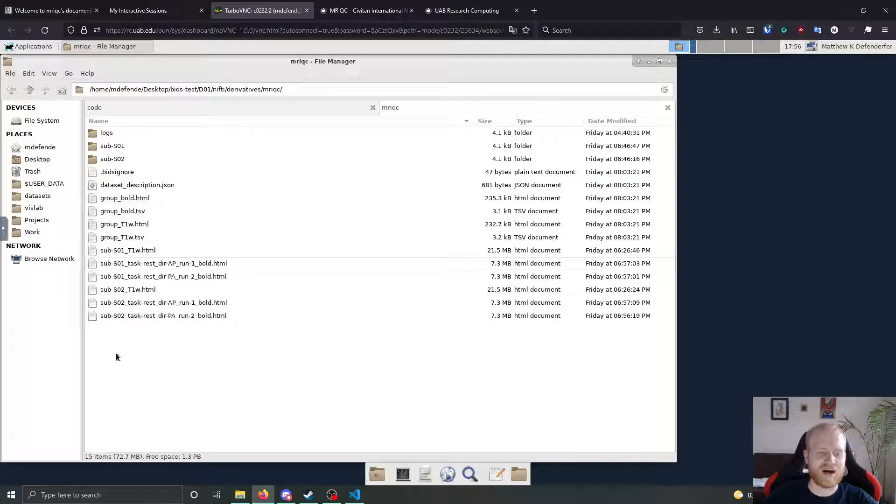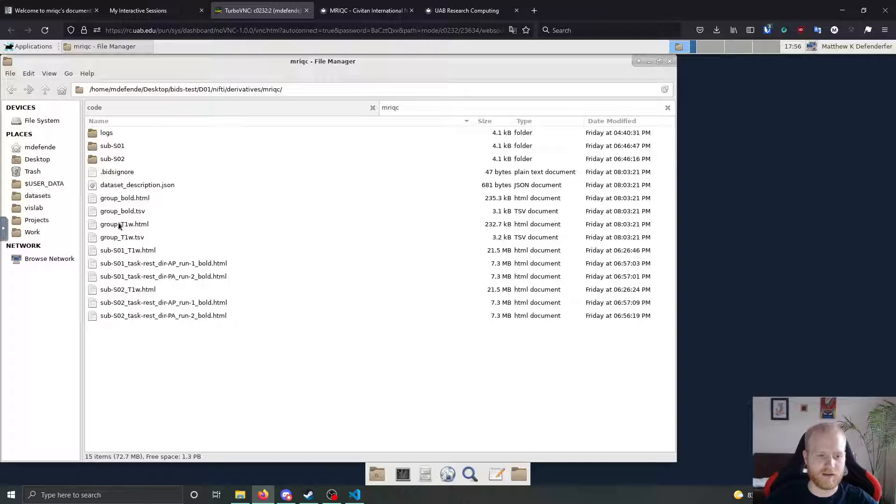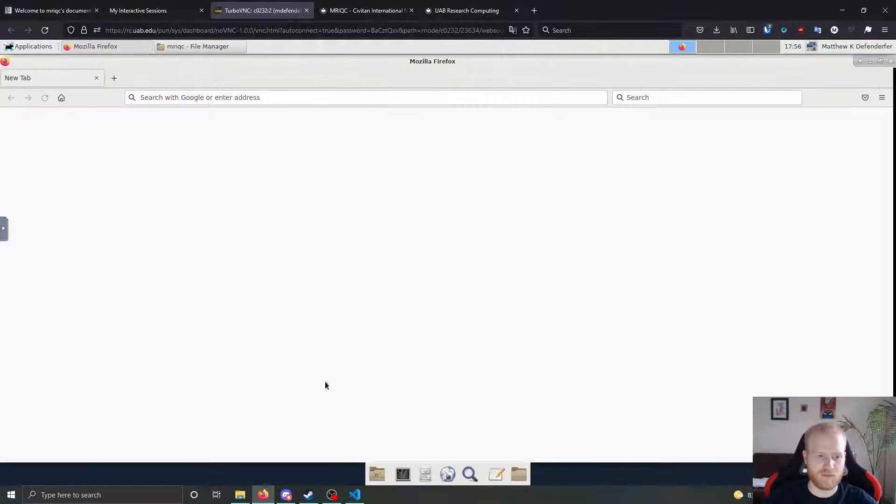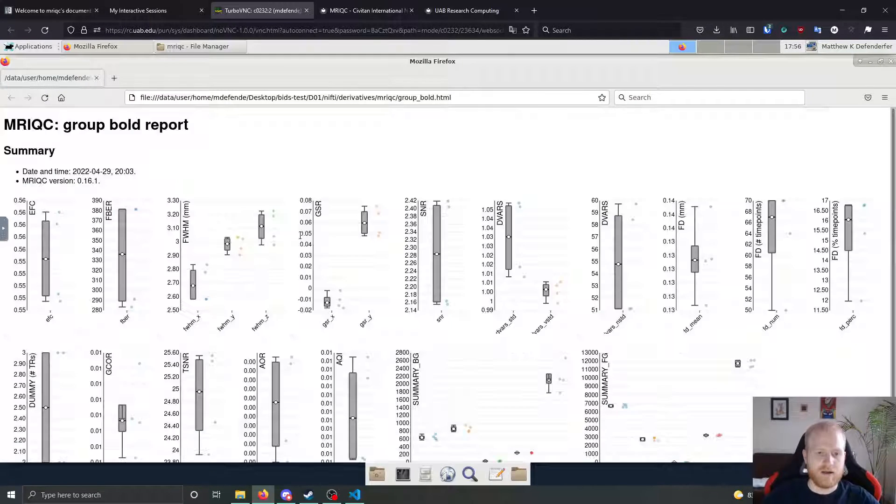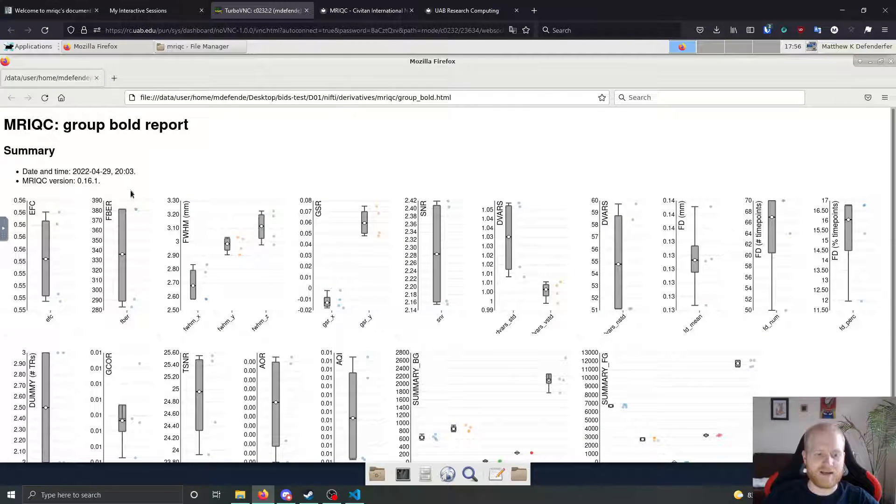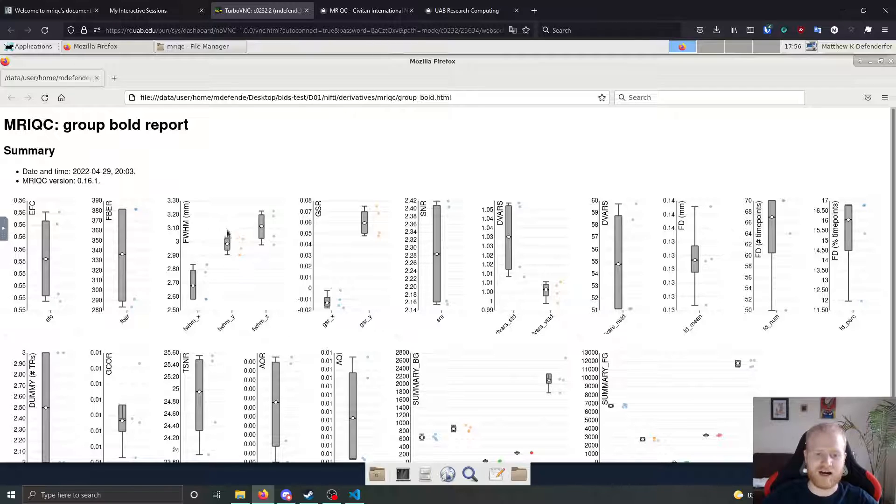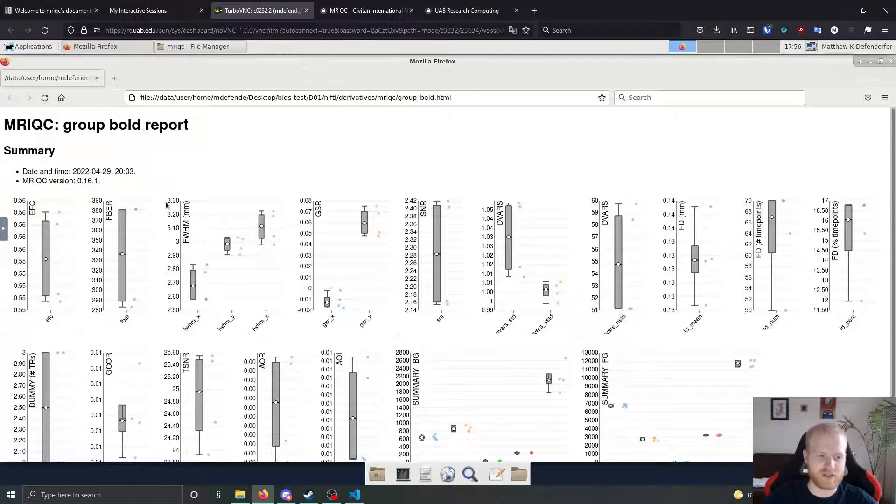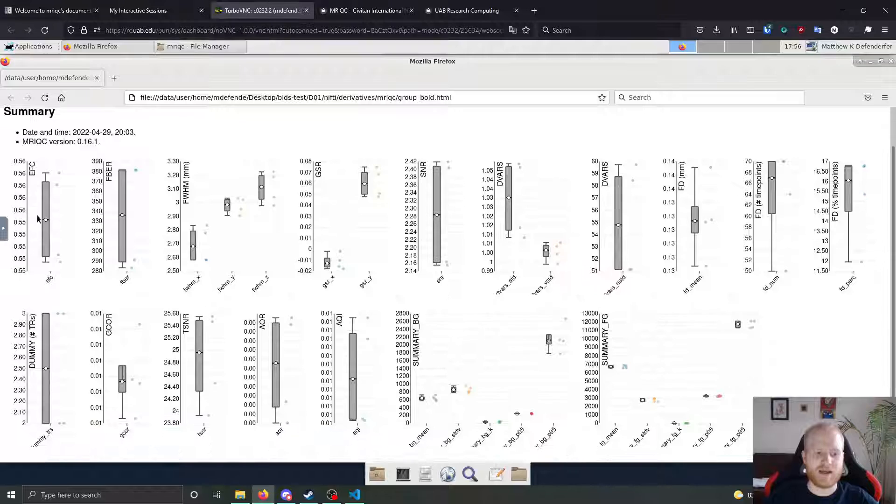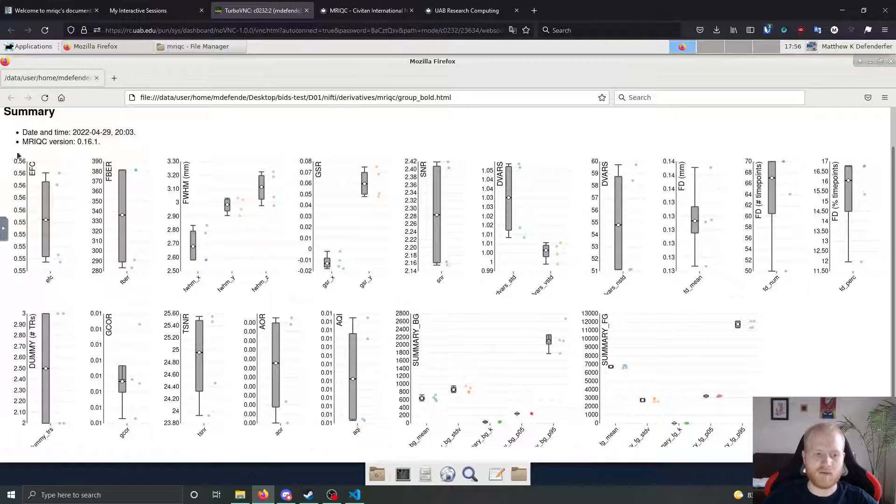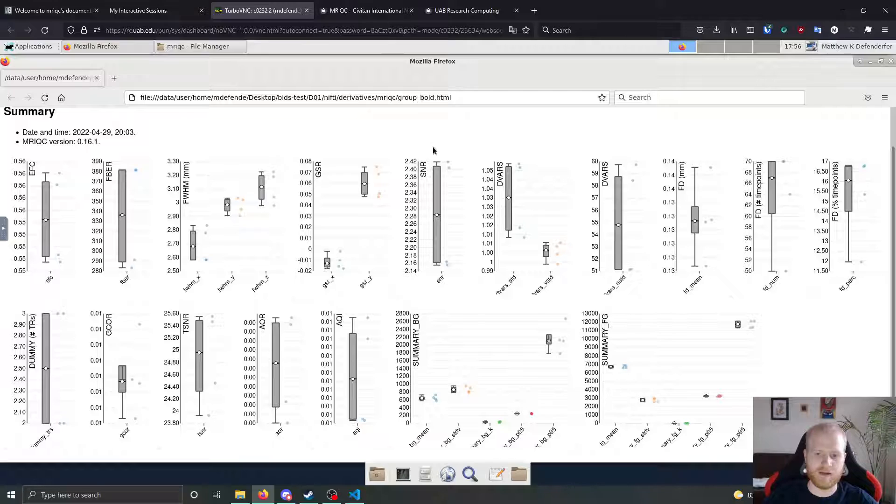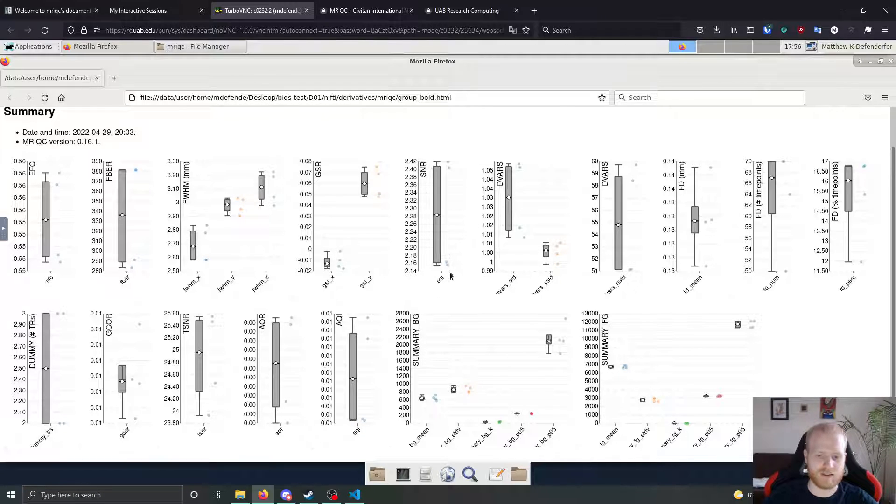So if we look at what the outputs of those are, if we look at the output bold group bold, it is going to have a data point for each bold scan that it finds. In our case, we have two bold scans per subject and two subjects. So we have four data points. And it gives you a list of all of the image quality metrics that it has data on and then plots those points on these plots.